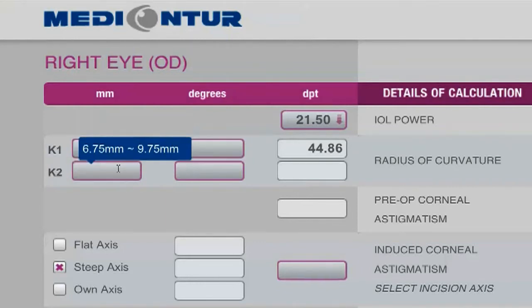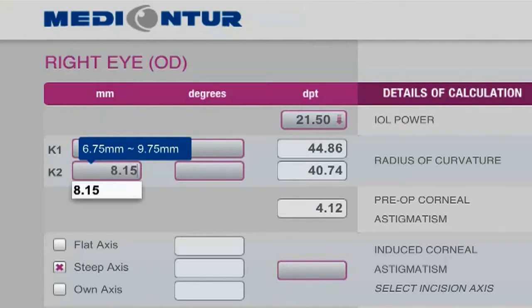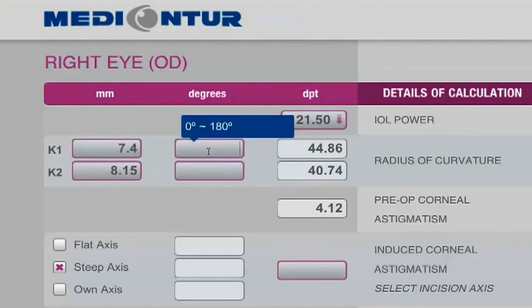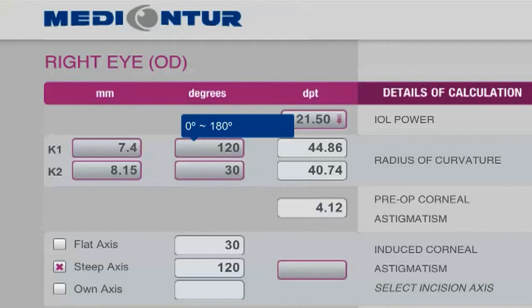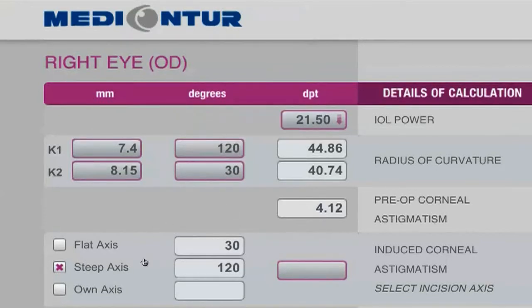Keratometry can be entered in millimeters, thus offering greater precision in terms of final results. While entering the degrees of the axis, the second degree is automatically calculated with an exact difference of 90 degrees, to once again make the data capturing easier and faster.